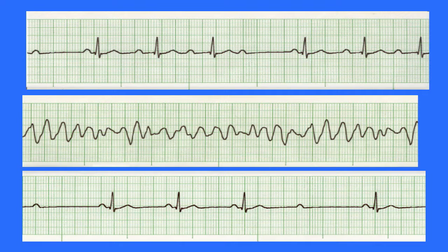And then it resets to a PR interval that's normal, and then longer, and if you had more, you'd have another drop beat after that. So this is a prolongation of the PR interval with drop beats. So this is second degree AV block type 1, and the other names for that would be Mobitz 1 or Wenckebach.